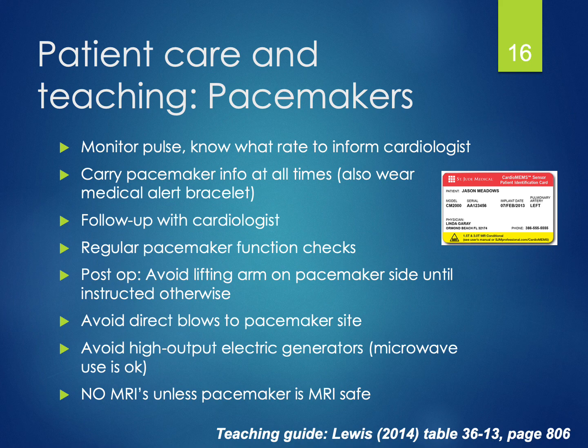So the patient should also protect that site, so avoiding direct blows to the chest. And this might sound strange, but let's say that they have a very energetic grandchild. They need to be really careful around those kids that are not really aware of how forceful they might be. Not putting themselves in any situation where they could take a hit to the chest, so kind of taking it easy for a little while.